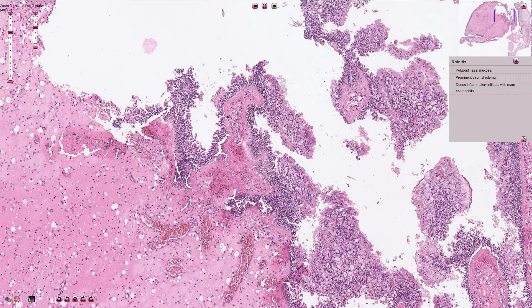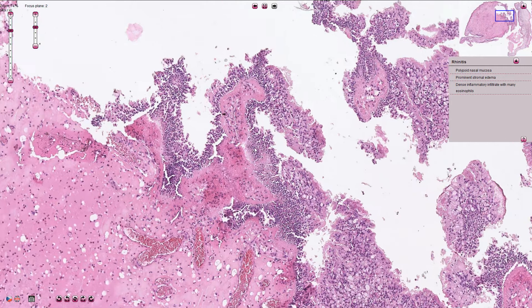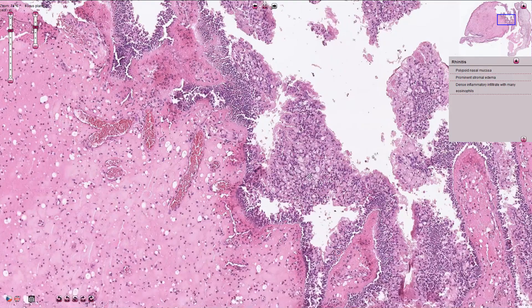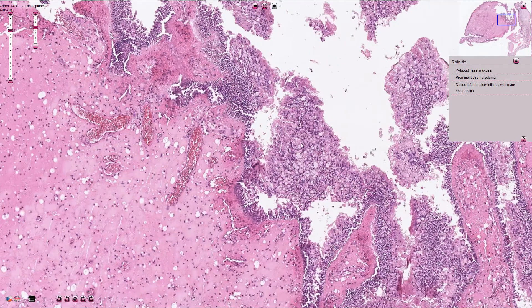Sometimes we can see papillary transformation of the mucosa, as in this place for example. Here we have the papillary structure with the fibrovascular septum. Also quite prominent goblet cell hyperplasia can be seen in this mucosa.